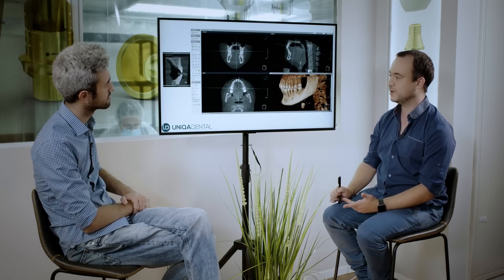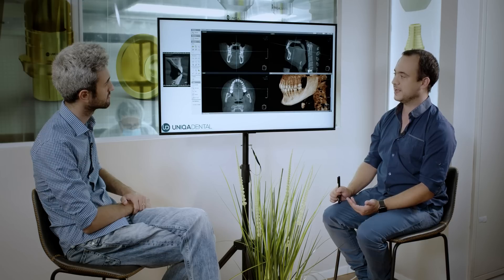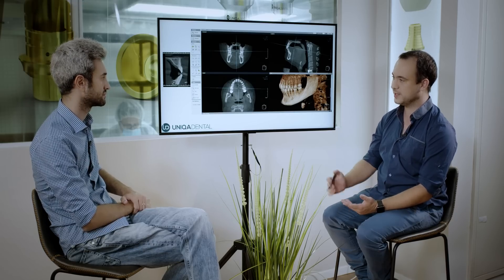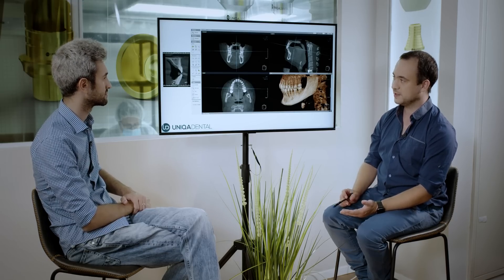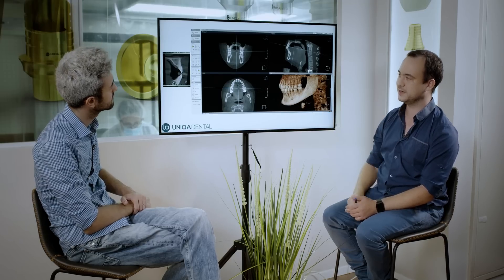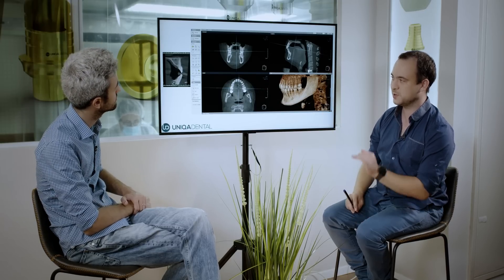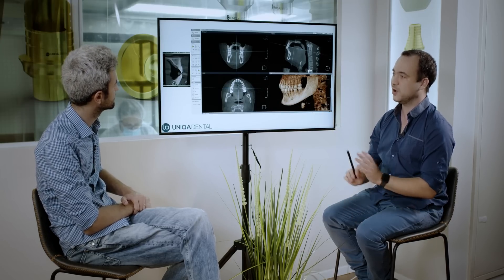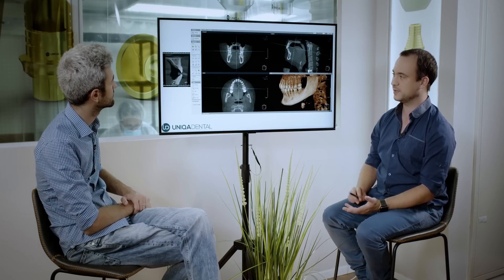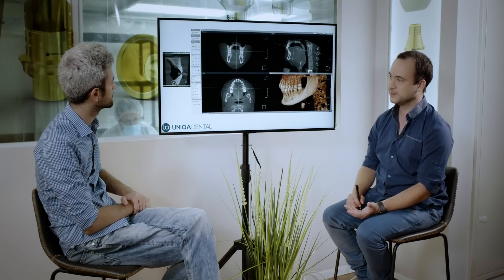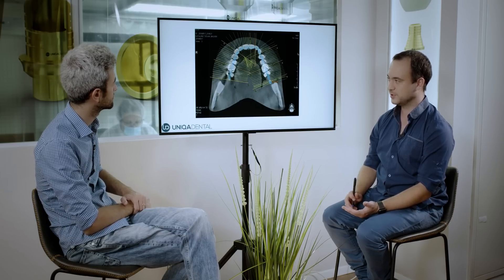So in this case we need to make some modifications to these slices. The end result I want is a perpendicular slice for every point in the jaw. You know that it's perpendicular — you can see the height, the width, all of the parameters. By this slice you can choose what implants to use and how to restore them in future treatments.